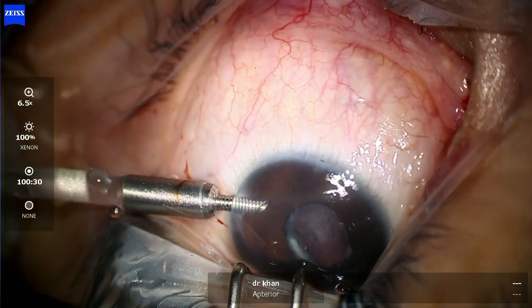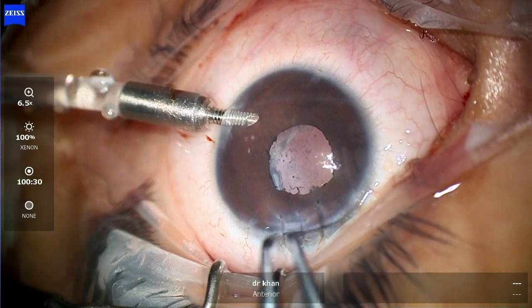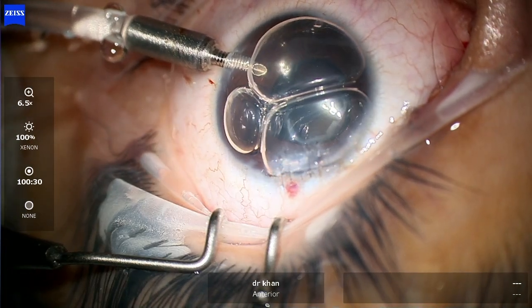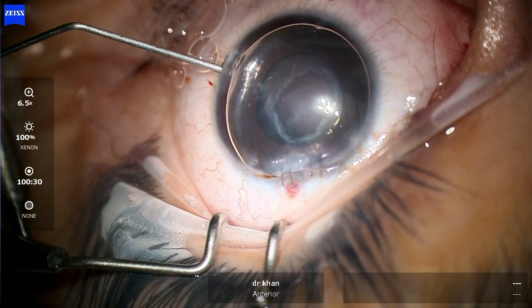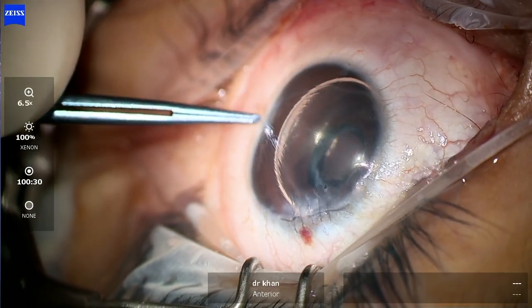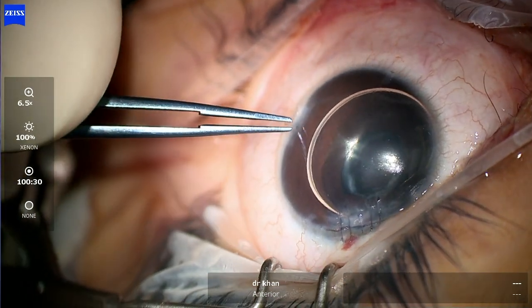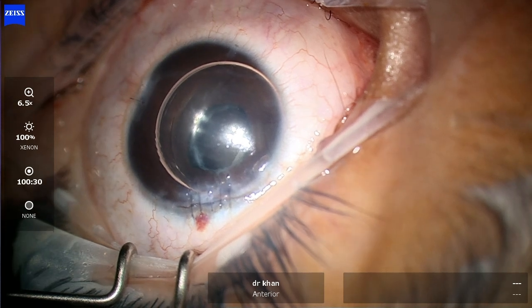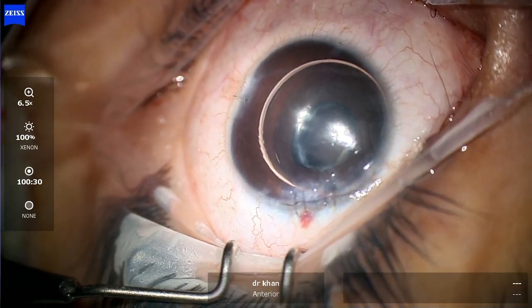The lens is now inside the bag. The main wound is closed by 10-0 Vicryl. I'll introduce some air and then remove the AC maintainer and also close the infusion site. It's nice to use some intracameral heparin just to avoid inflammation from the vitreous manipulation — that reduces it — and also use some conjunctival cefuroxime, dexamethasone, and triamcinolone on the orbital floor. The patient is now almost 10 months post-op and is doing really well, has excellent vision. We still left him slightly hypermetropic — he's around plus 4 — and there's only a difference of about 3 lines between the other eye and no intraocular inflammation whatsoever. Thank you very much for watching.